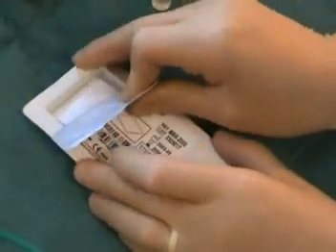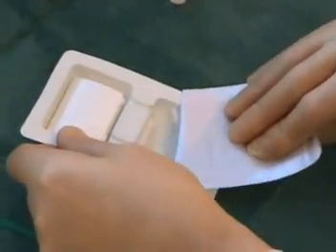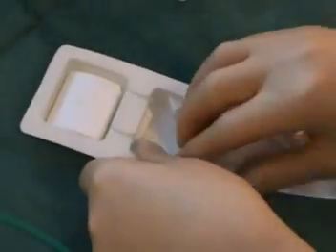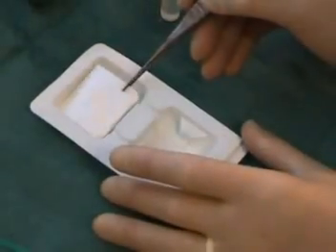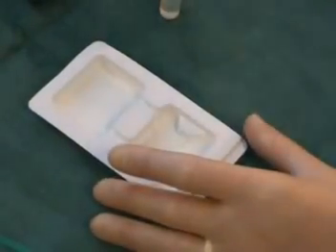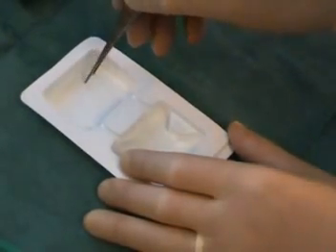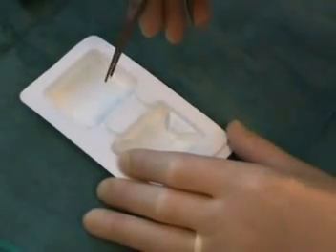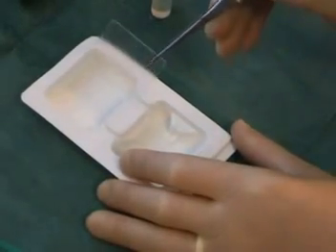The membrane and templates are packed in a sterile plastic blister. After opening the blister, the template is removed from the packaging. The membrane itself can then be found in compartment A of the blister pack.